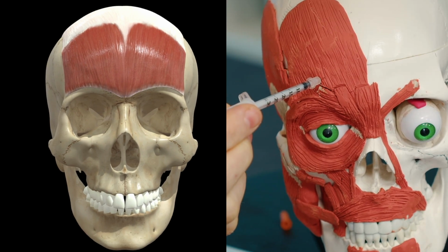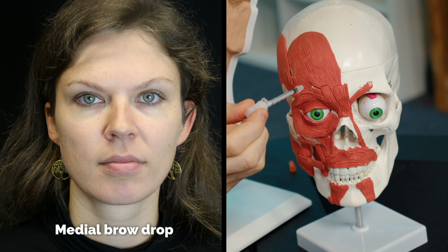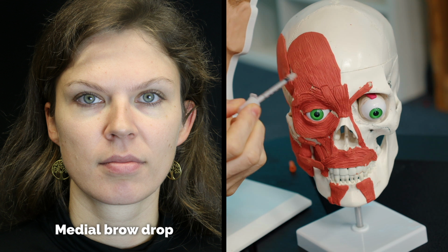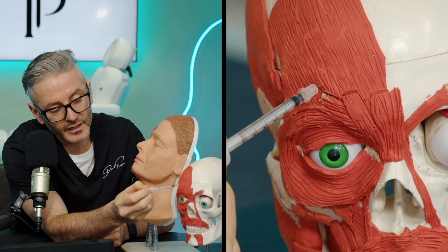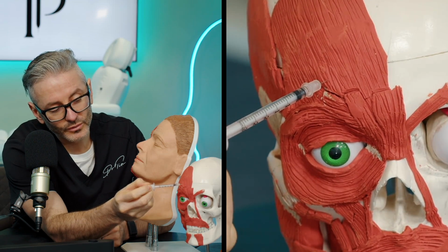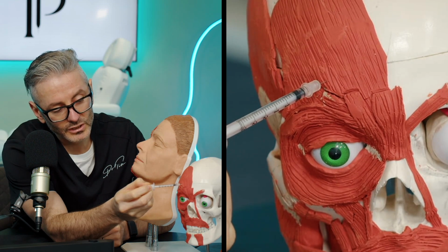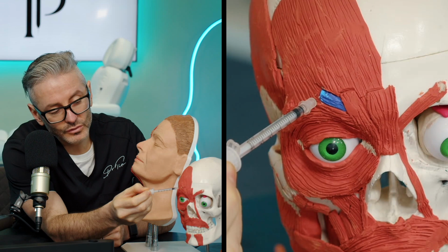And what you will do if you inject the frontalis muscle here with a hefty dose or even a light dose is cause a medial brow drop. It's right in the area where we need brow elevation all across the forehead. So this area might improve horizontal forehead lines, but it's also going to cause a medial brow drop in a high percentage of patients. So if you then move down about 5 to 8 millimeters, you should now be in the insertion point.